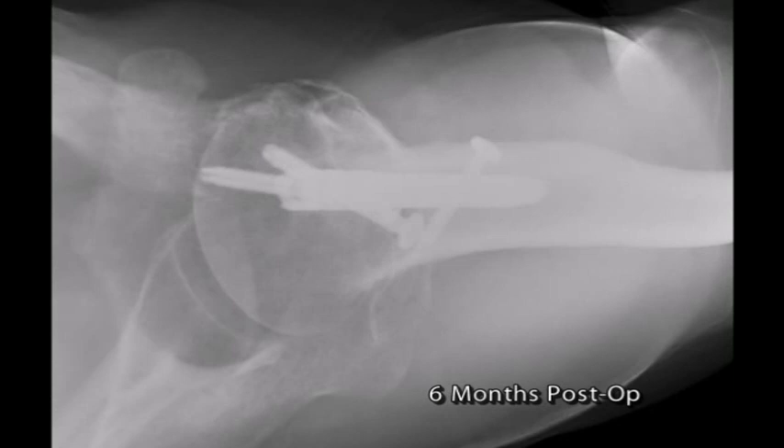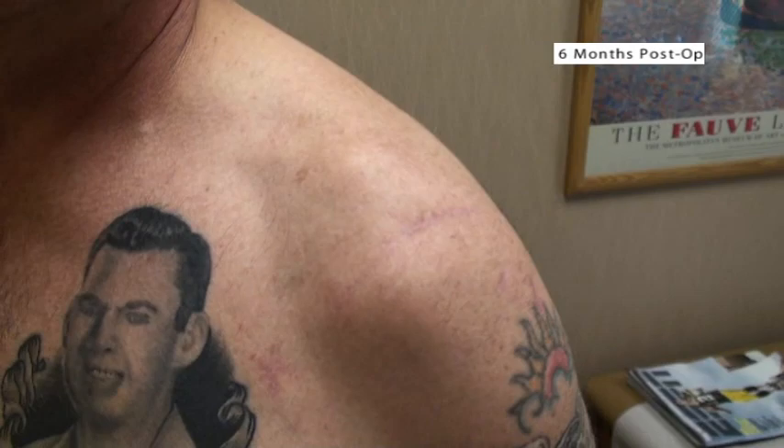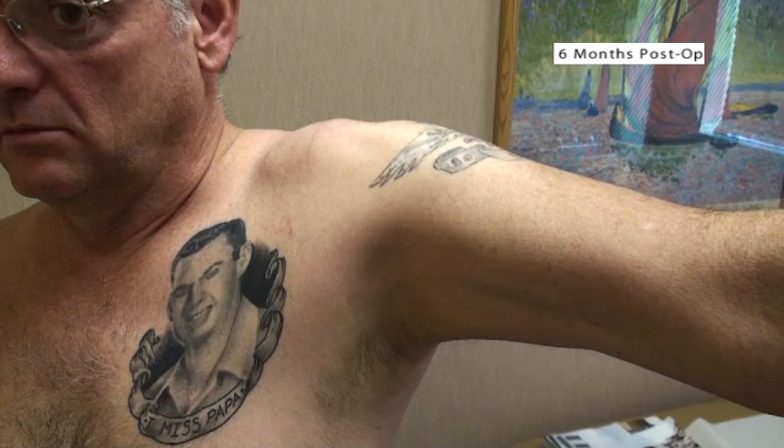As noted during the technique video, there is minimal to no exposure of the fracture at the surgical neck. In our experience, this lack of damage to the blood supply of the fracture site and humeral head has likely helped lead to the favorable results that we have observed with intramedullary nail treatment of these fractures. Here's the patient's follow-up — his incisions are well healed and his motion is near full in all planes. Let's listen to the patient's account of his own recovery.